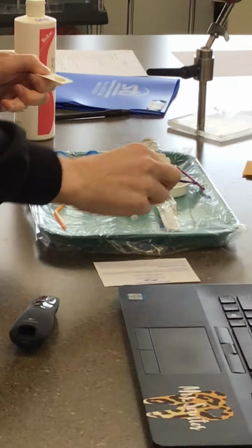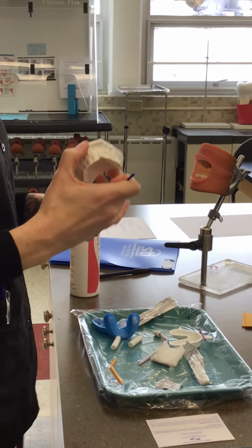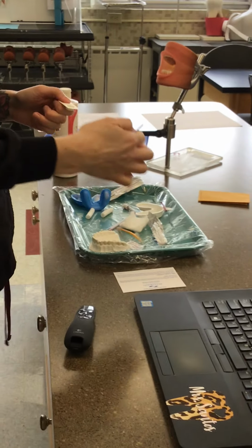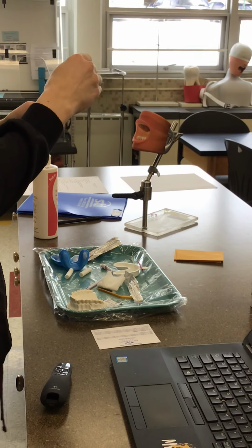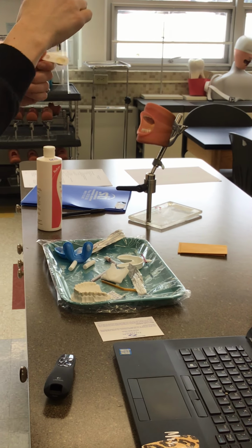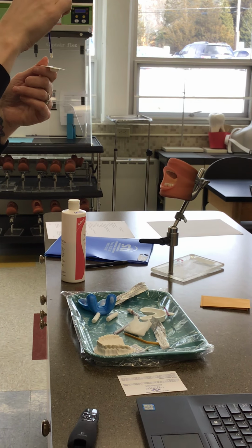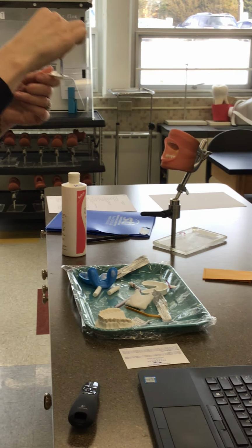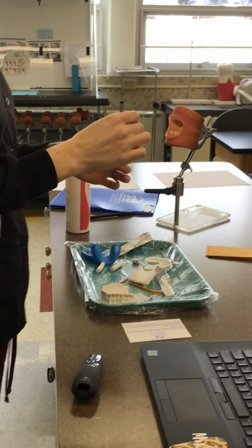So when we apply our varnish, we're gonna use one of our stone models, okay? It's really difficult to clean off of the Typodonts, so trust us, you'll wanna do it on this. So we take it and we mix it, okay? It's gonna be the first thing that we do. And so you can see it's kind of that consistency I was saying, like Elmer's glue, right? So it's loose, but not super watery. So you can't really do this wrong.